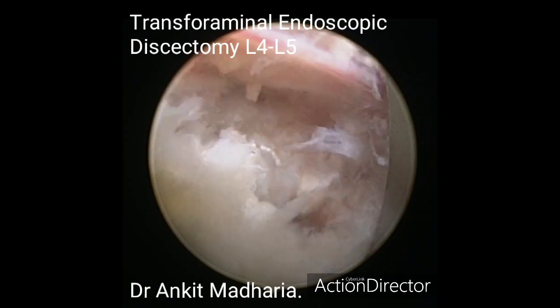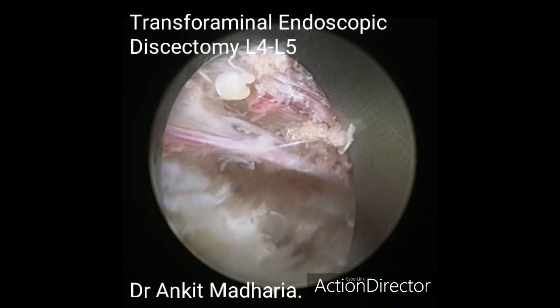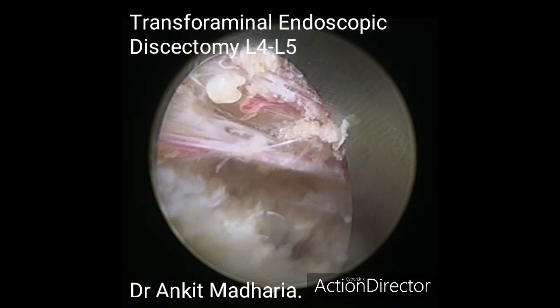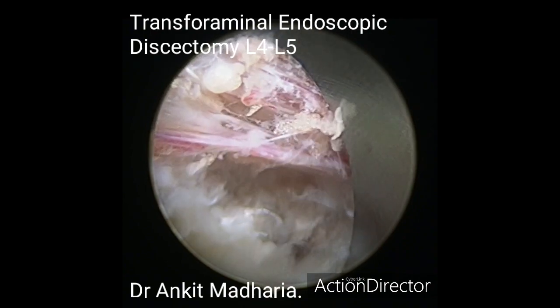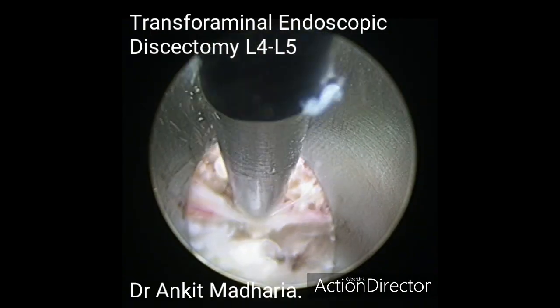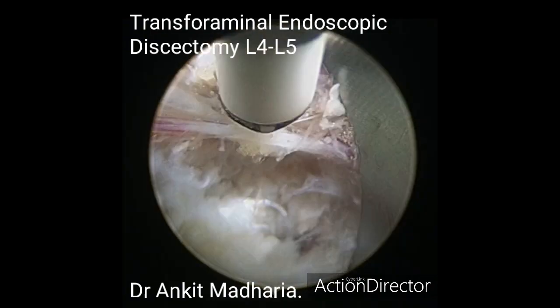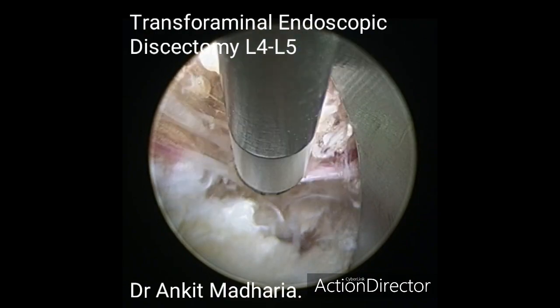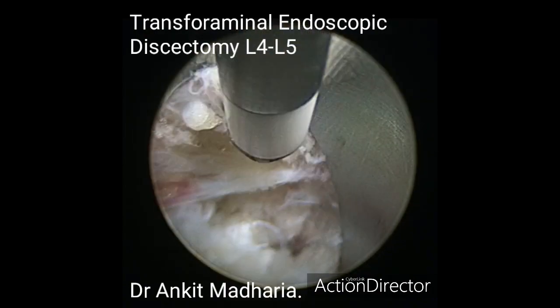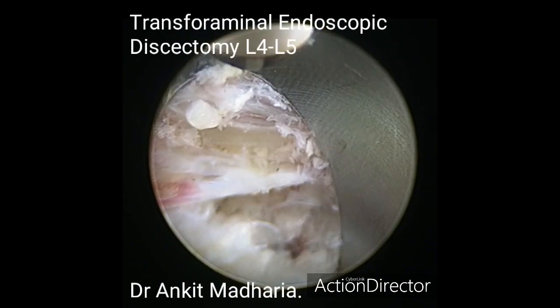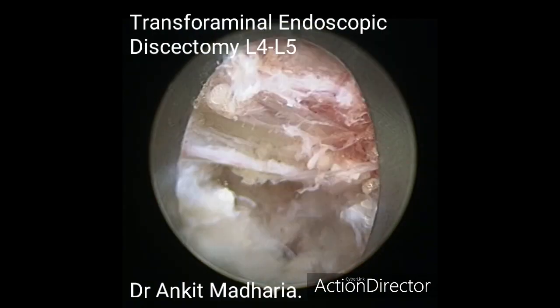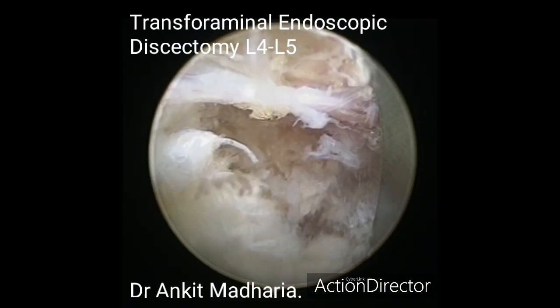Here you can see the epidural vein come into the center of our view, which will be coagulated with our radiofrequency bipolar probe. The bony structure you will see now is the superior articular process of the L5 vertebra.